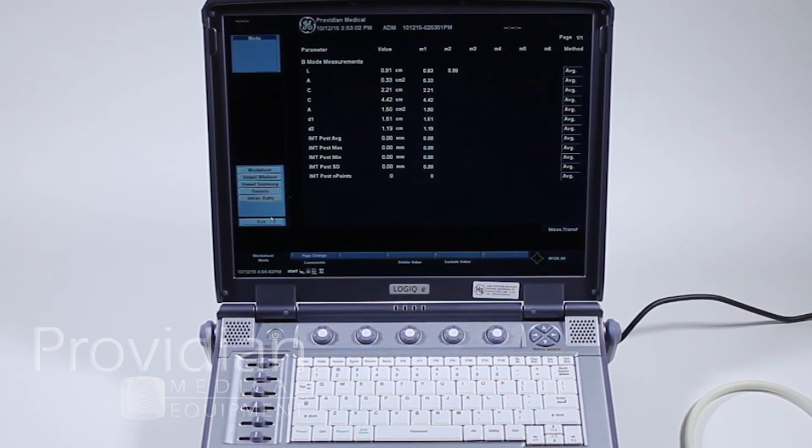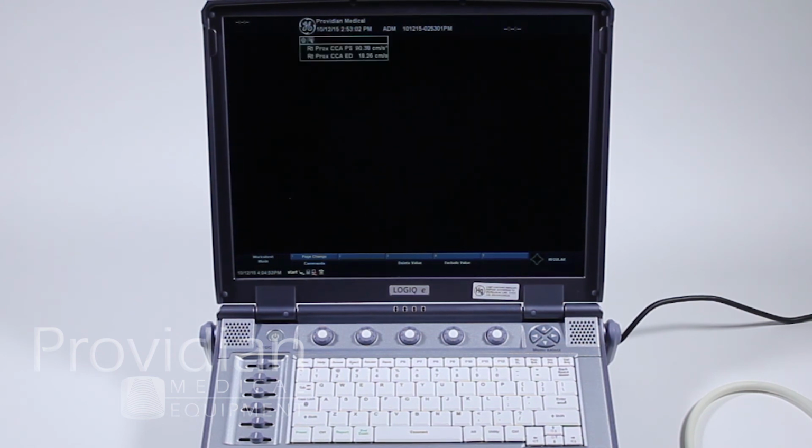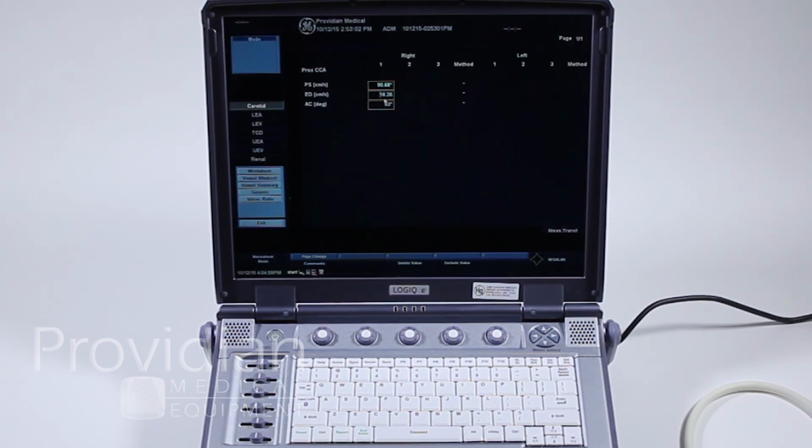So we'll go ahead and exit, and these are the items that would go out on the report right here for the vessel summary. We did the proximal CCA, peak systolic, end diastolic, and again, if we want to change that, we go to the worksheet. Oops. And make that change right there.